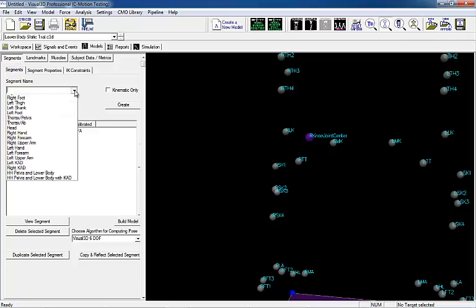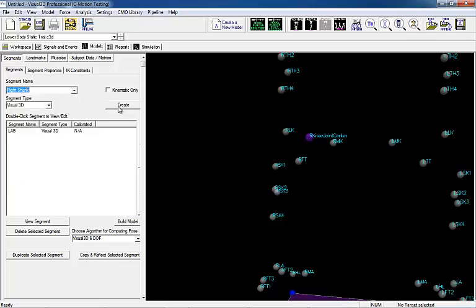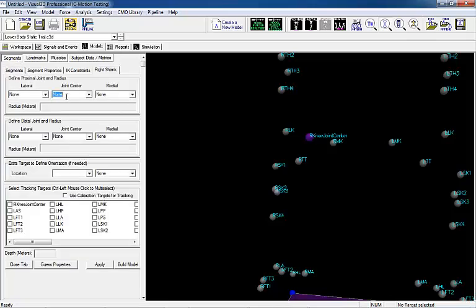The proximal end of the right shank segment will be defined using the landmark which was just created. The distal end of the right shank segment will be defined using the lateral and medial ankle targets.